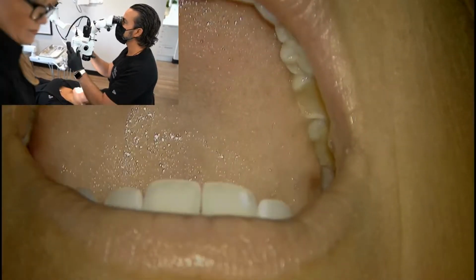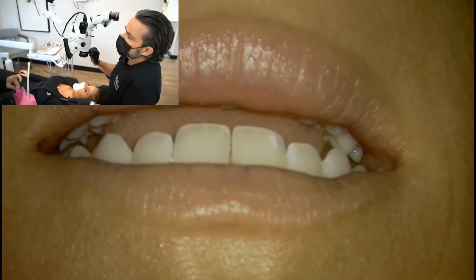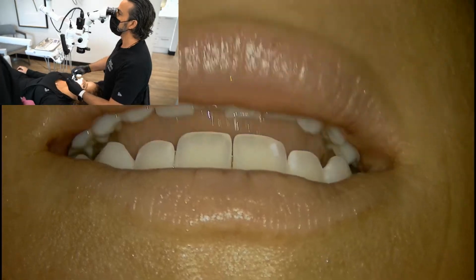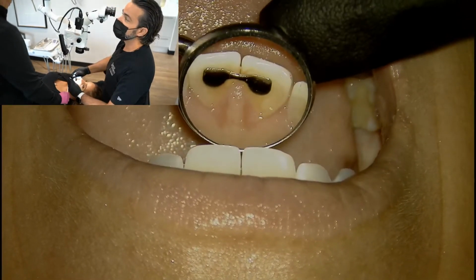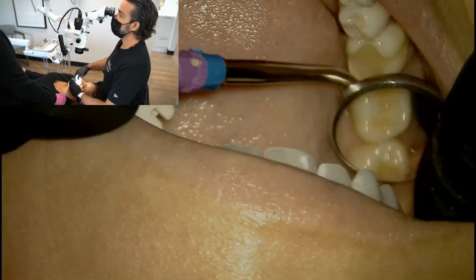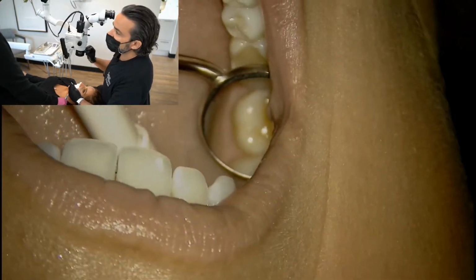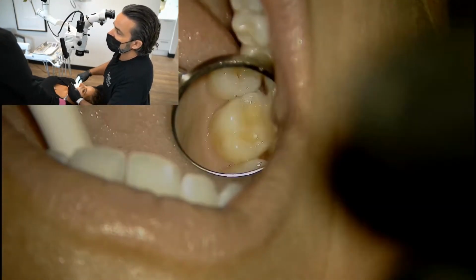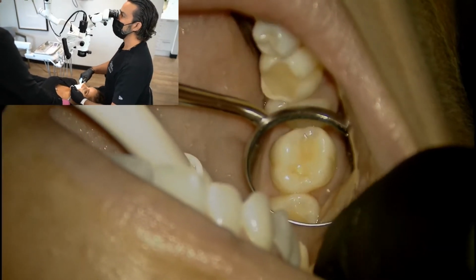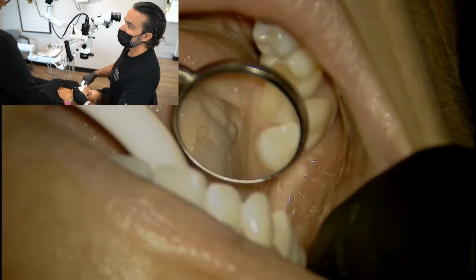All right, so I'm in the 12 o'clock position. I can obviously see that I'm in focus. We'll do a tutorial on focusing here in a second. But the mouth. So in the 12 o'clock, I'm just going to look at the screen so I can see what you're seeing. There we go. I can look all around the mouth.